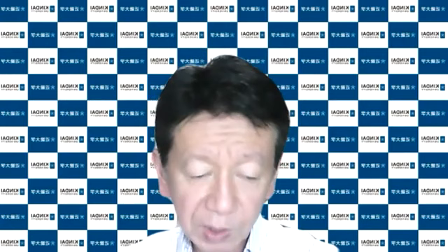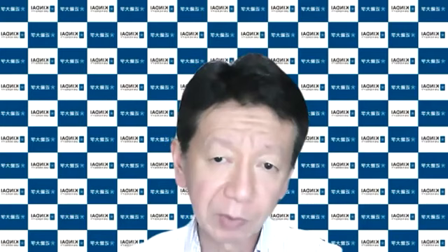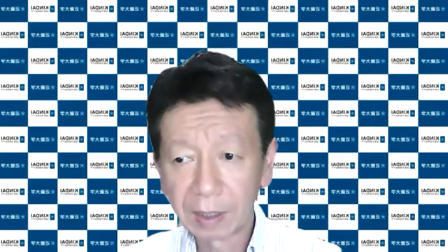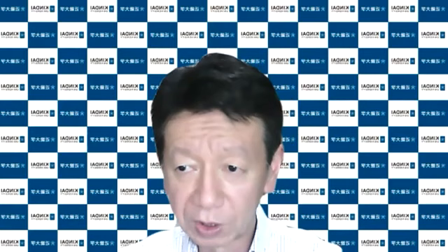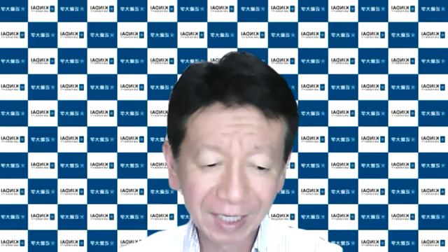Yes, it's more or less, because we thought in some patients that there was some traction to the inner wall. Sometimes I do inner wall retinectomy in such cases, but we don't decide surgery only by the findings from Silverstone. Of course, we consider visual acuity and other factors for the decision. But as the presence of traction is something we want to remove, that maybe moves me a little bit toward the decision of surgery.